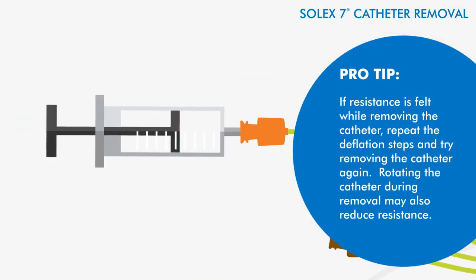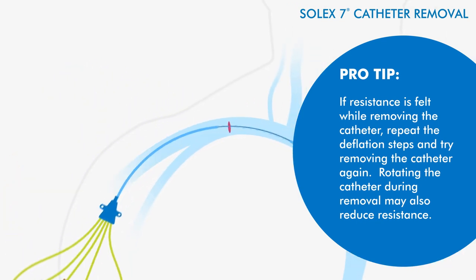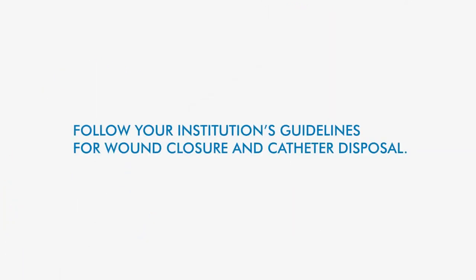Open the out port of the catheter and remove the syringe from the in port. Keep both ports open while removing the catheter. Follow your institution's guidelines for wound closure and catheter disposal.